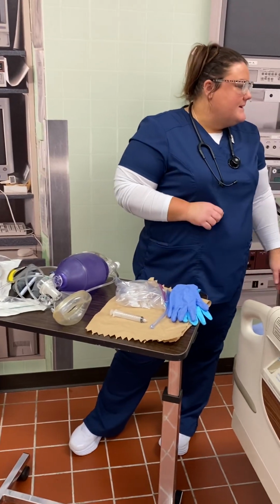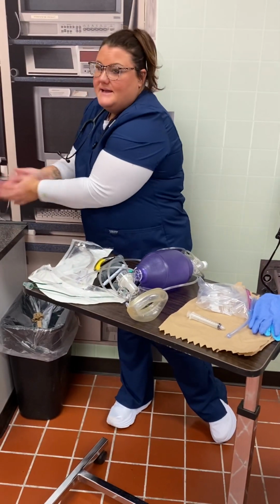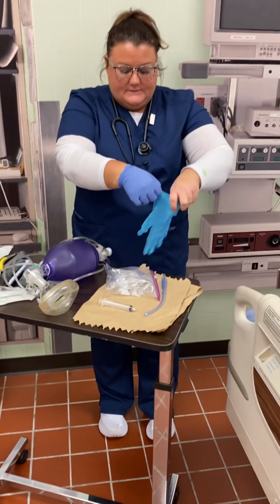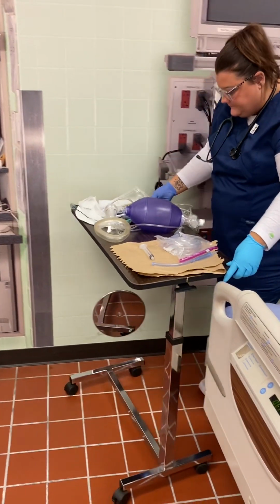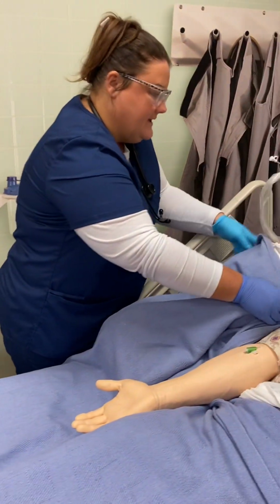Hi, Mr. Smith. My name is Kim. I'm from Respiratory. I'm here to see if we can get that tube out today. So I'm gonna go ahead and wash my hands, grab some gloves. Move my table over here. How you doing today, sir?